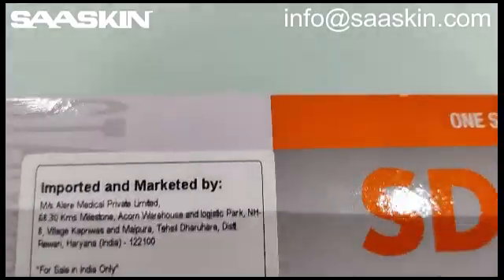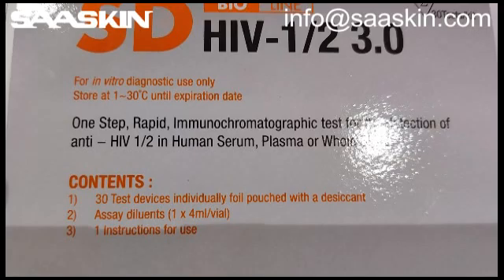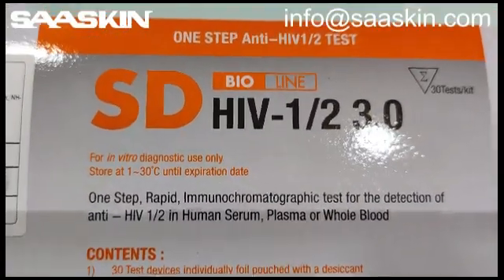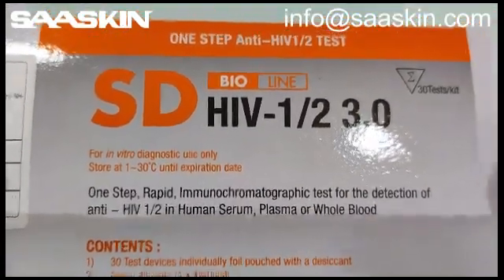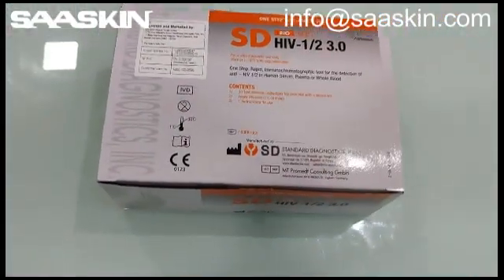Here quickly to show you — this is the HIV 1/2 antibody test cassette. Let me unbox this for you.